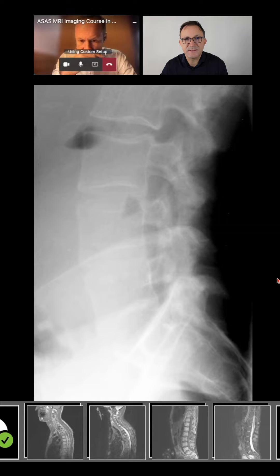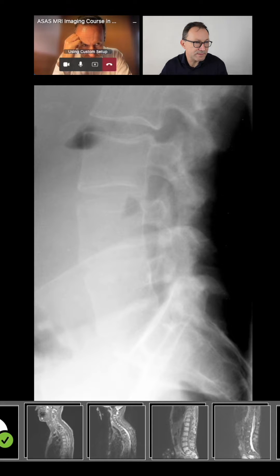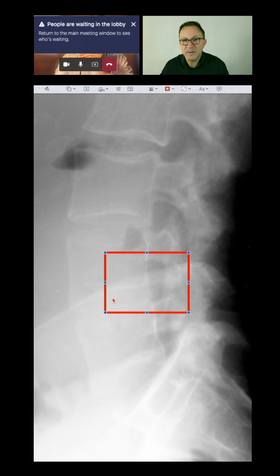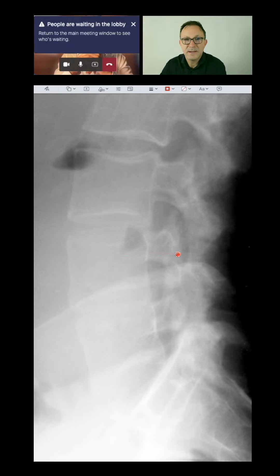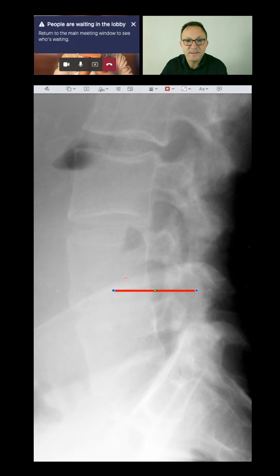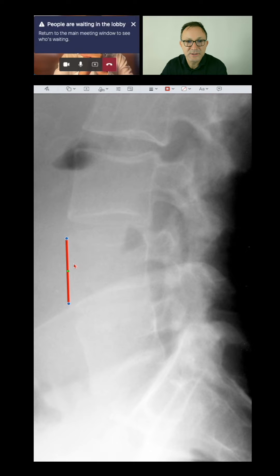That is good that we are able to discuss it. Let me explain it by this image — it's a very useful question you bring up. So what's a square? A square is something like this — a rectangular shape with sharp corners. That's usually not how the vertebral body is; usually we have vertebral bodies that have round corners. We see that the vertebral anterior edge — this is the vertebral anterior edge — has a little bit of a curved shape.